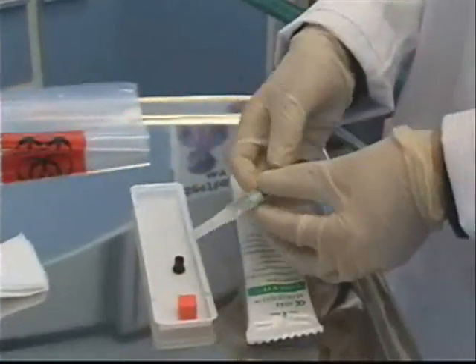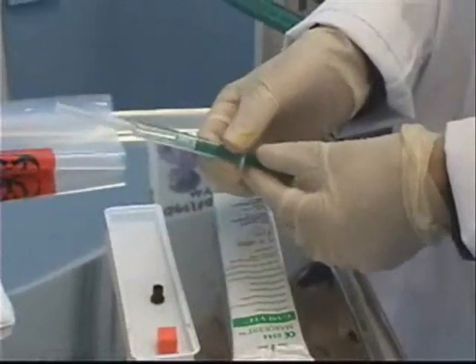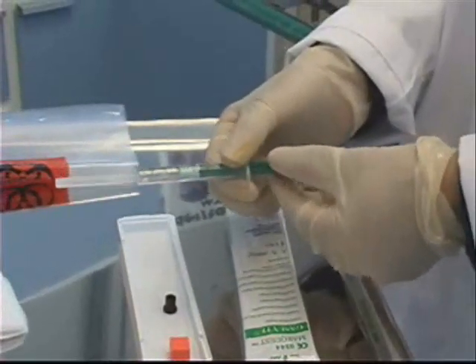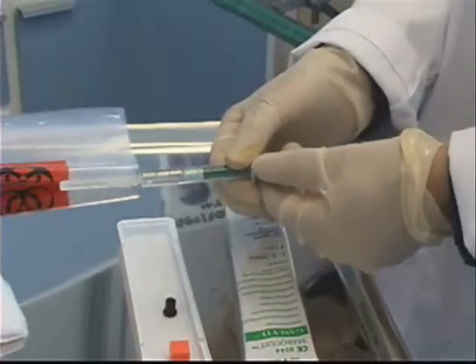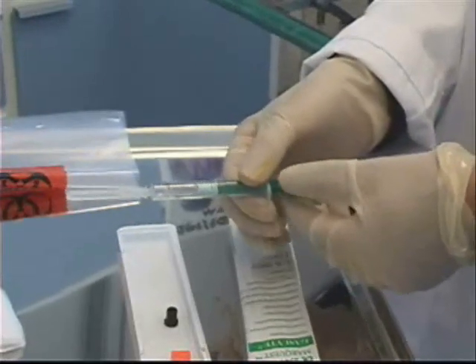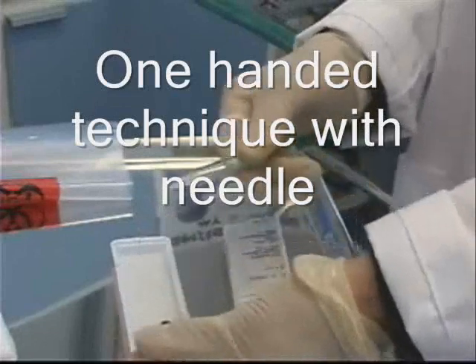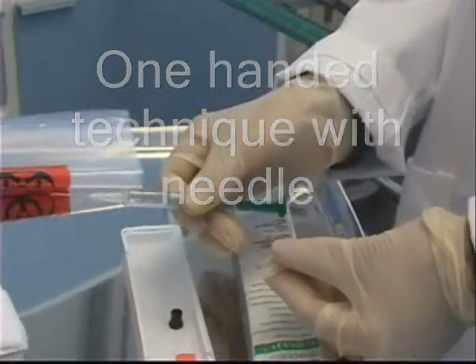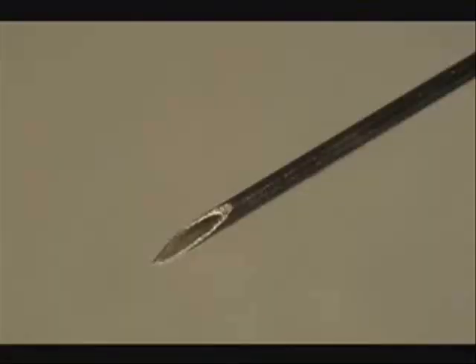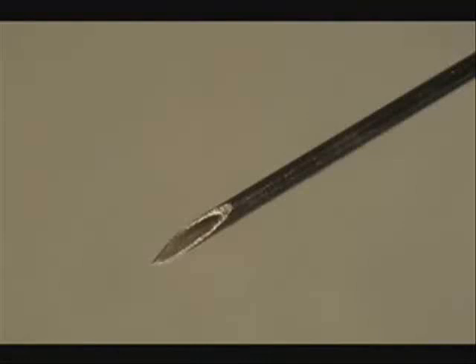I'm going to pull back slightly on the plunger so that once I've got the needle in the artery, the arterial pulsations will push back and fill the syringe. I'm going to slide the cap off the needle and make sure I can see the bevel, so I know to insert it bevel-up when I go through the skin.